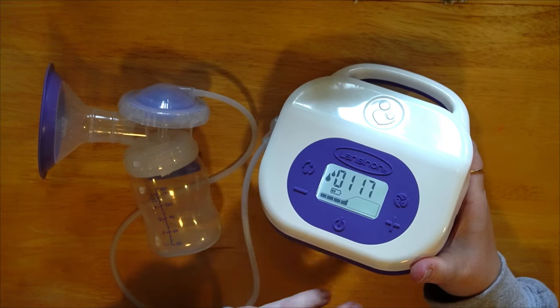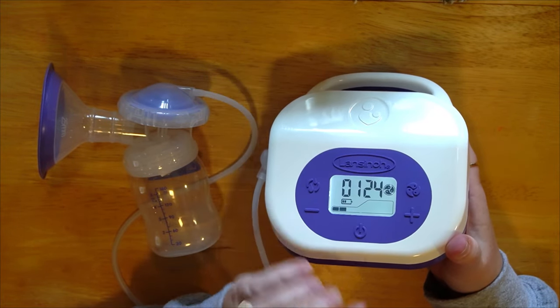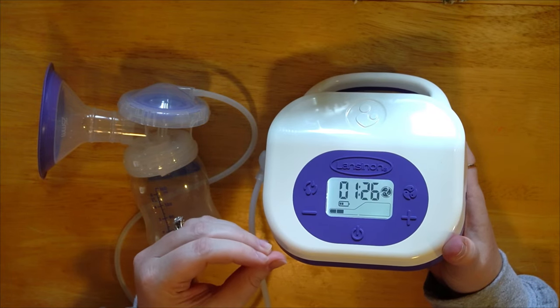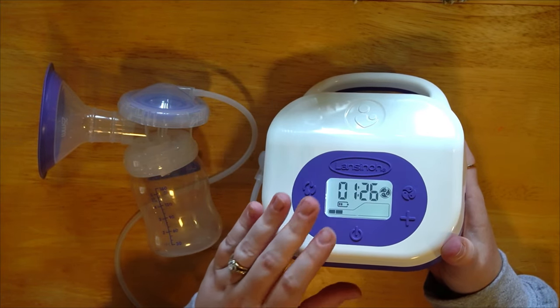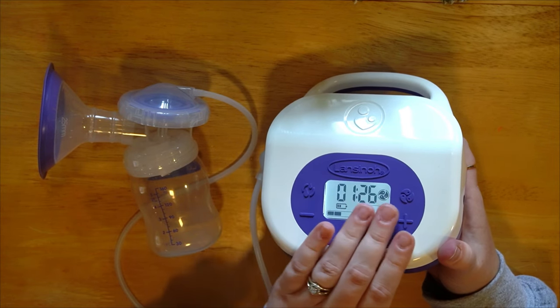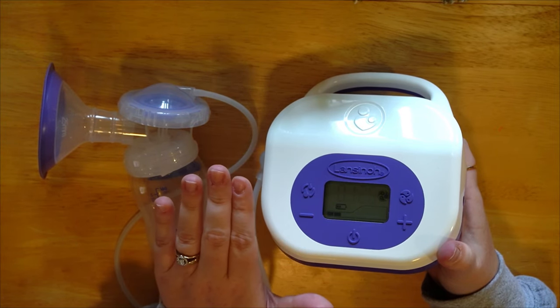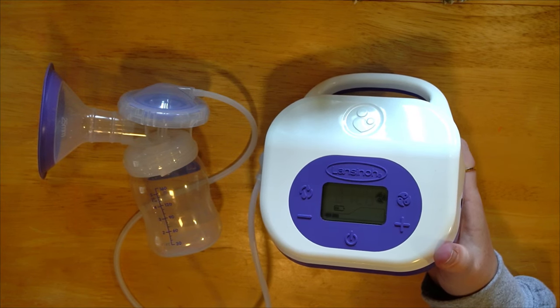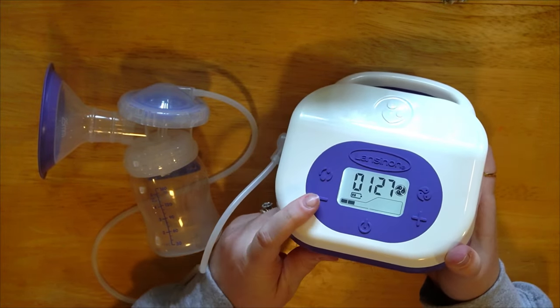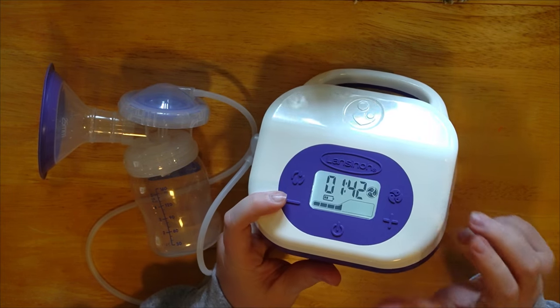In stimulation mode the pump stays on a timer and kicks you over into expression mode after a while — you can see those drops disappear when it switches. Stimulation is to start milk flow; as soon as you have milk flow you can switch to expression. Getting a letdown can take a few minutes. If the timer tries to kick you into expression before you've had a letdown, press the button and go right back into stimulation. Nobody makes the rules here — it's about what's good for your body.